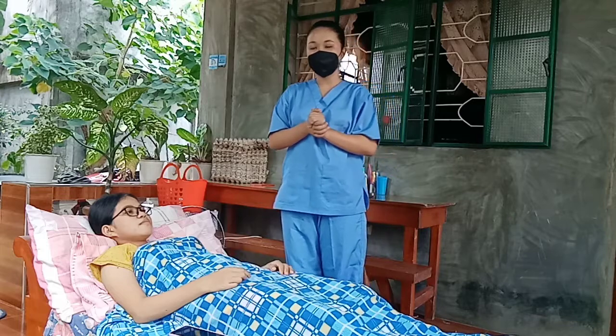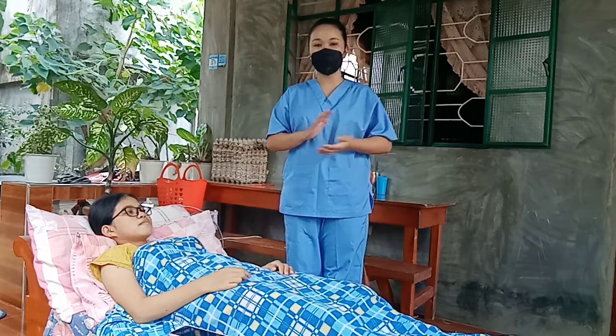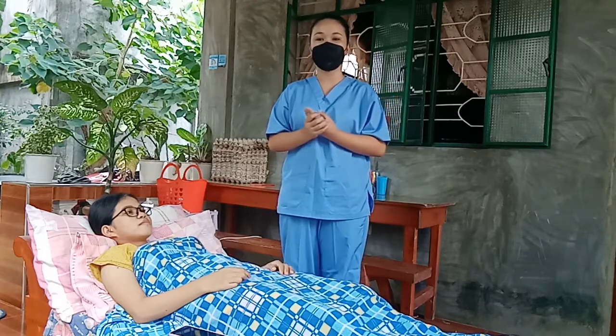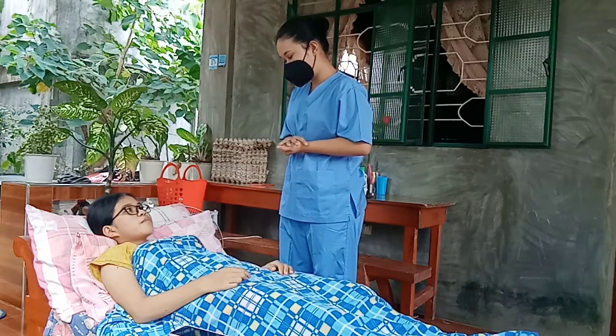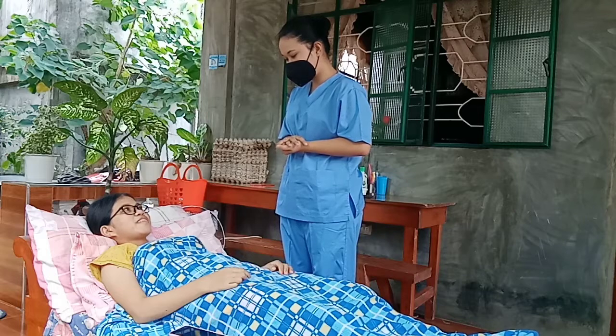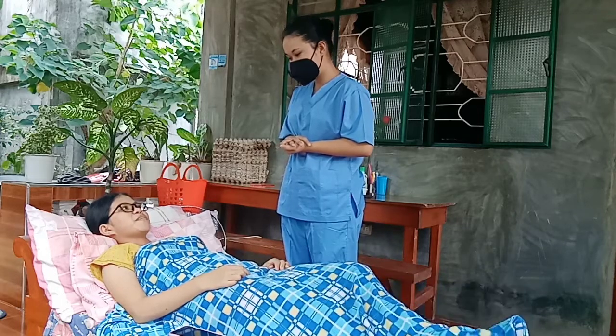So first, we should do the assessment. Number one is identify the patient using at least 2 identifiers. So what is your name and birthday, ma'am? My name is Jessamine Serrano and my birthday is January 21, 2006.